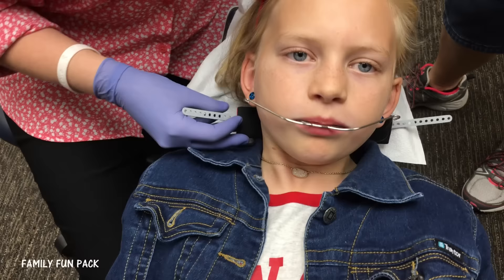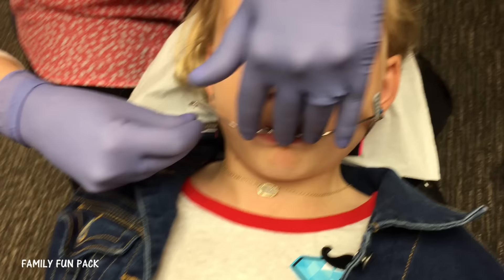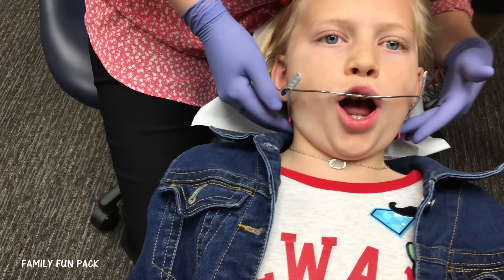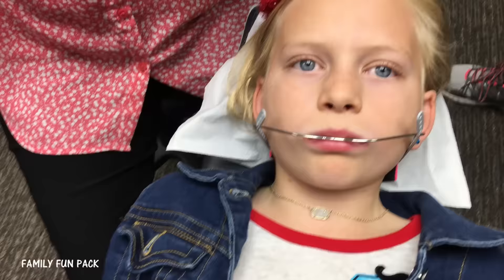Go ahead and lean back — I just don't want to pull your hair. Let me just kind of see where we're possibly going to be starting. It's going to feel a little tight to you. Okay, Alyssa? That's normal. This is like pulling your top jaw back, sort of? It's actually holding the top jaw where it's at and allowing the bottom jaw to grow.